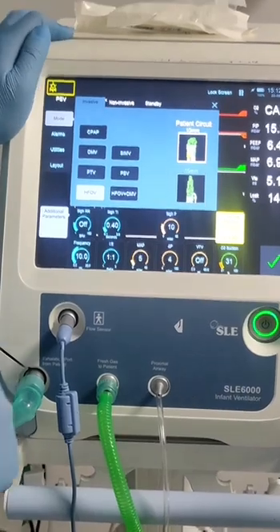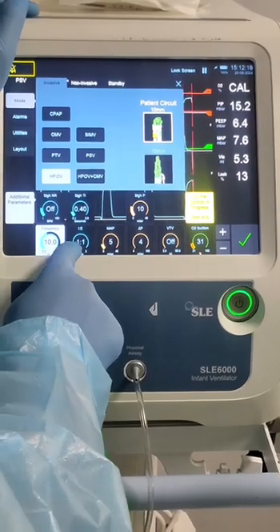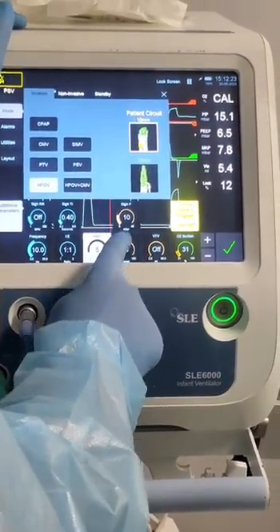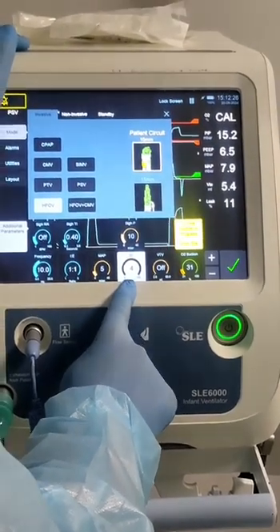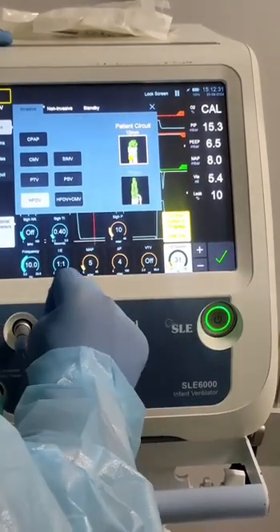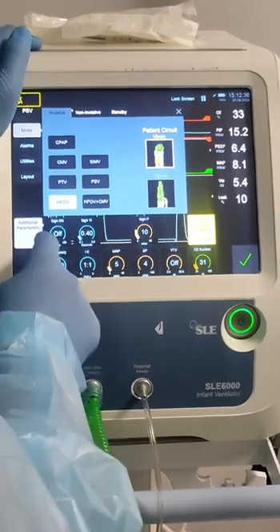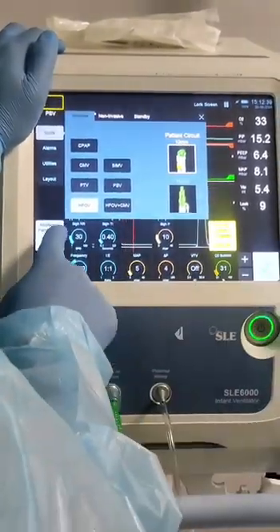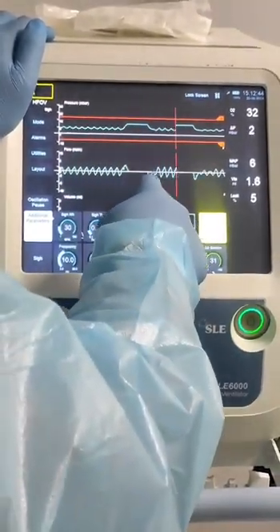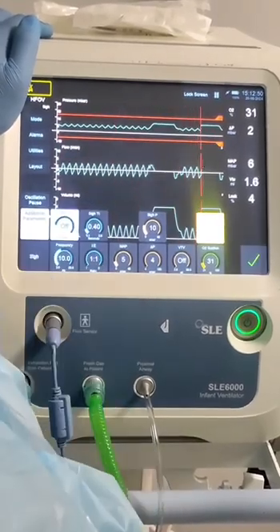We also have high frequency mode. You can choose the frequency in hertz from 3 to 20, the I:E ratio, mean airway pressure from 0 to 45, delta P from 4 to 140, and target tidal volume. Also the oxygen setting. We have an option for sigh — you can activate it for a longer breath, and it will give 30 breaths per minute and stop the high frequency, giving just the set pressure. You can also deactivate it.